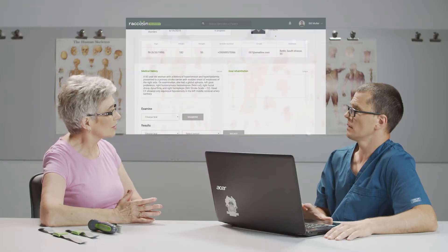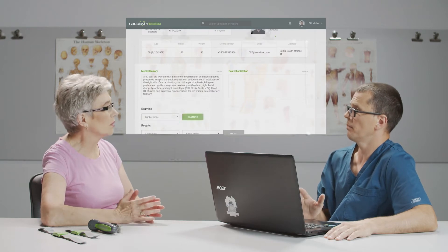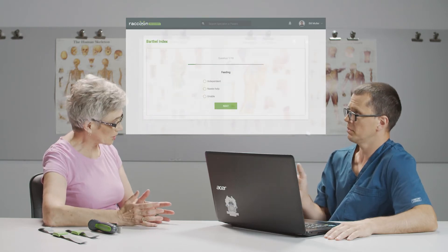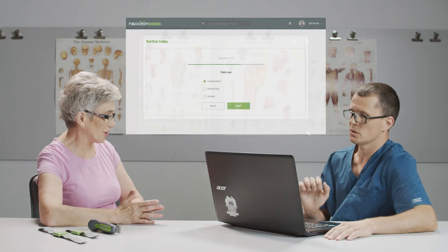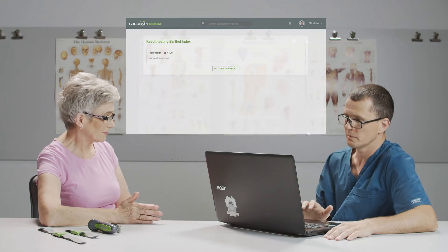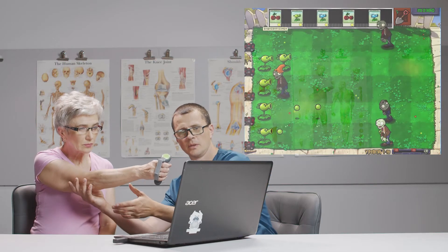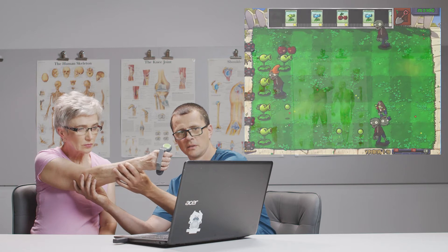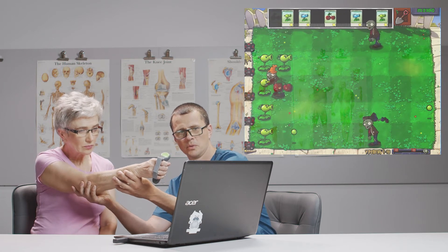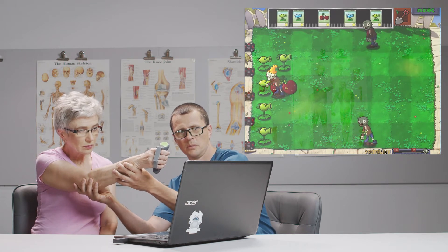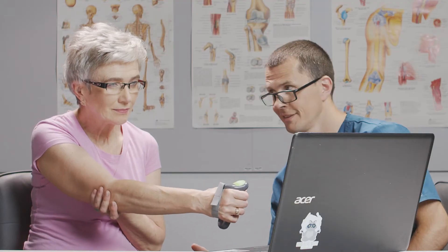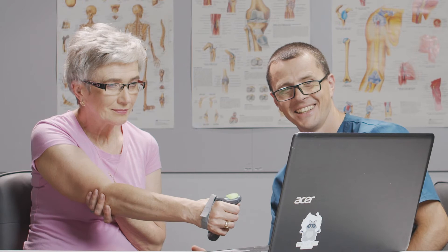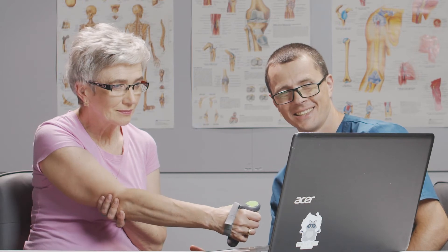Together with multiple survey tests digitized by Raccoon, it will help therapists to do quick and precise examination of patient conditions. The unique Raccoon Recovery algorithm allows connecting the controller to any existing video game on the PC. The rehabilitation process is conducted in the form of playing the patient's favorite video games with those movements prescribed by the physiotherapist.